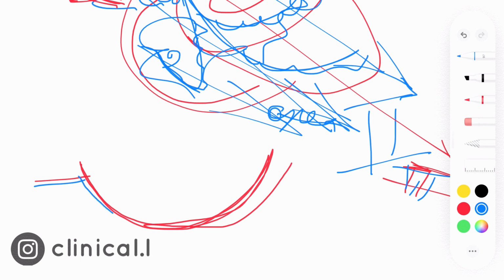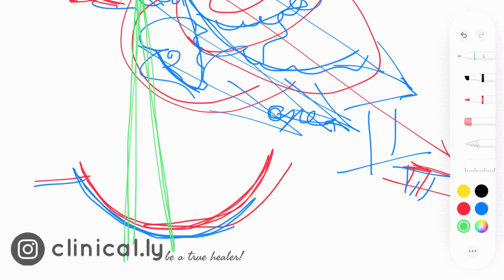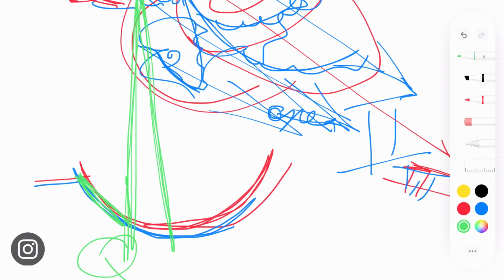This downward deformation was initiated by cell to cell transfer, but even before it gets completed, it is overtaken by a very sharp, gunshot-like deformation of the ECG. So this now becomes a Q wave. Actually, this is the recording of a different wavefront which was overtaken by this gunshot-like wavefront, creating this.